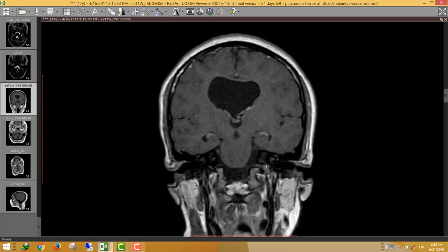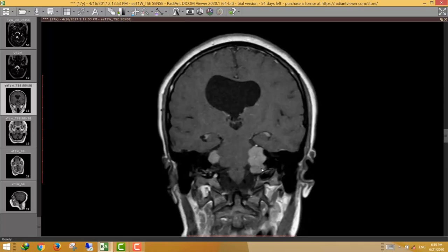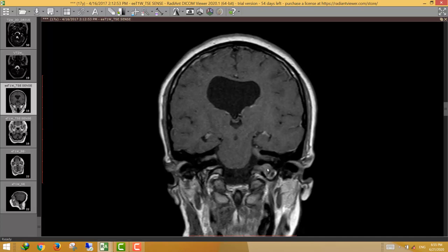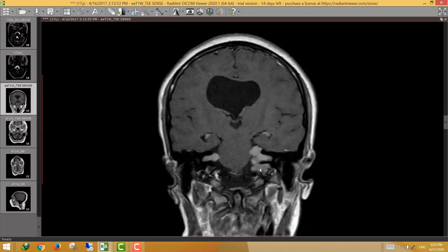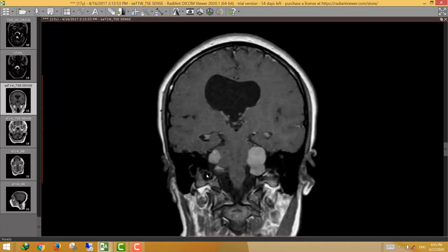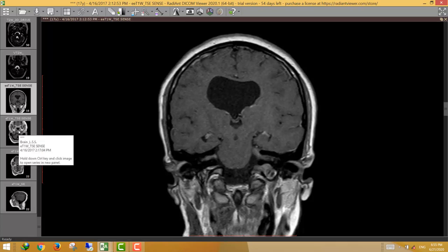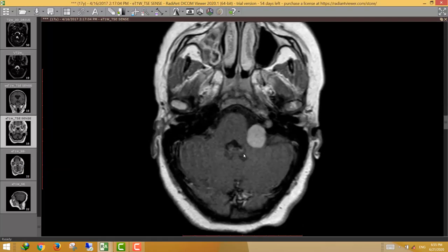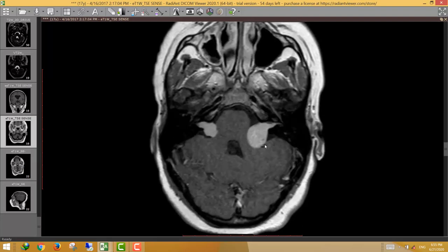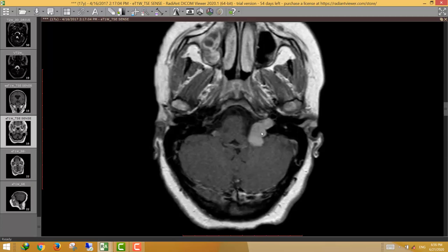We can see a lesion in the left jugular fossa and both cerebellopontine angles. The right jugular fossa and both hypoglossal canals are clear. So at this point, the patient has bilateral cerebellopontine angle schwannomas and a left jugular fossa (cerebellomedullary angle) schwannoma.